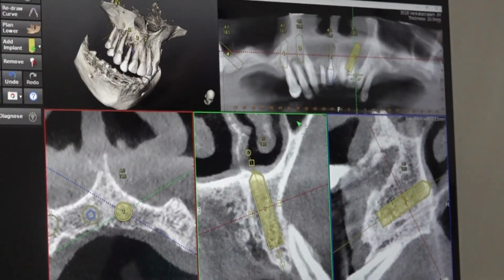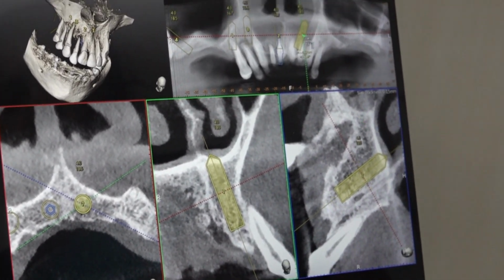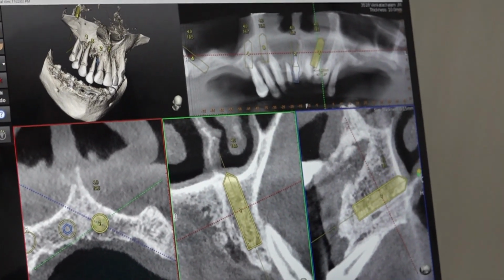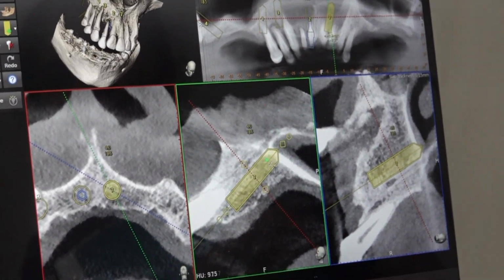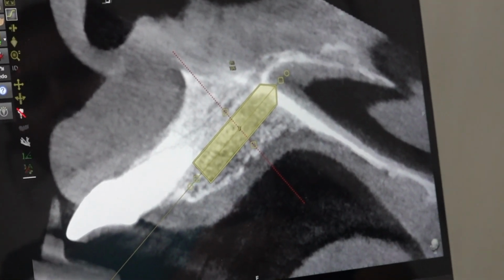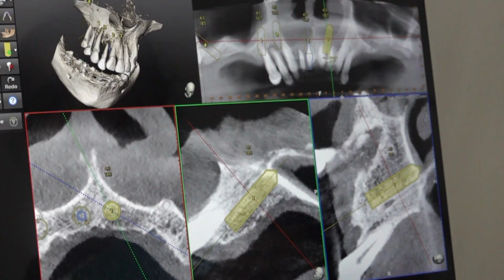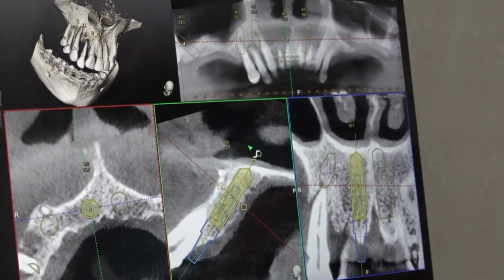If you see here, it is tilted distally. It looks like that is the problem with the panoramic image. If you move more mesially, you will become close to the nasal septum. Nothing wrong if you engage the nasal septum. But anyway, we are going to use a 15 mm implant only. So implants touching each other is not a problem, right?